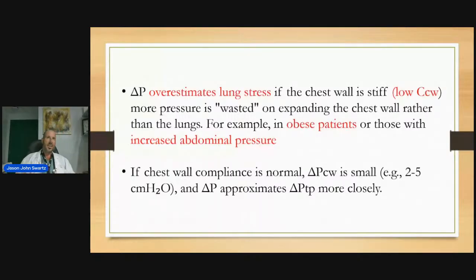You shouldn't be thinking, we just intubated. Maybe this patient's intubated for something that has nothing to do with the lungs. Maybe they are on low FiO2s, 25, 30, 35% or something like that. You just don't automatically think, I'm going to put a PEEP of 5 or 6. Like already, if you see this large abdomen, you know that there's a significant amount of pleural pressure.